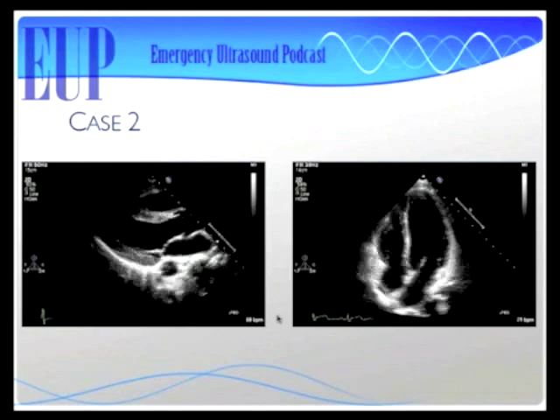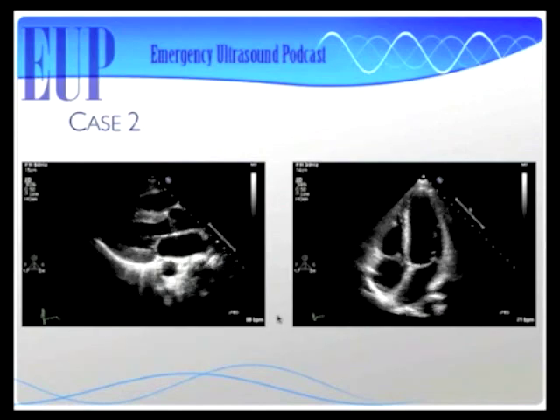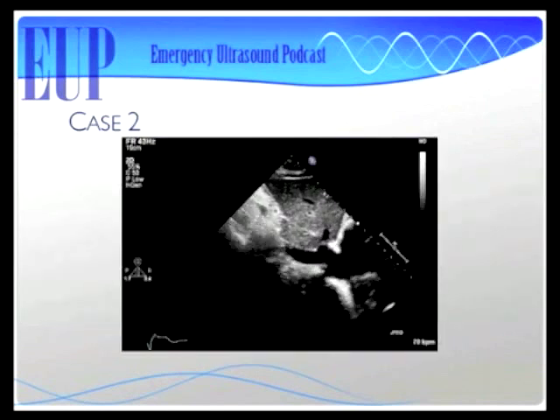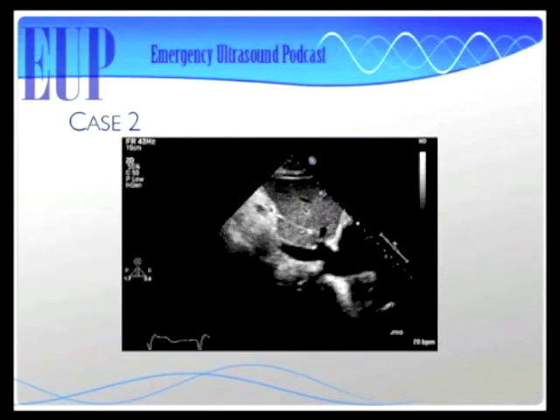All right, whatever. So next we've got the IVC. So now we're taking a look at the IVC. We get a sniff. And what do we see when that patient sniffs for us, Matt? It's collapsing some.